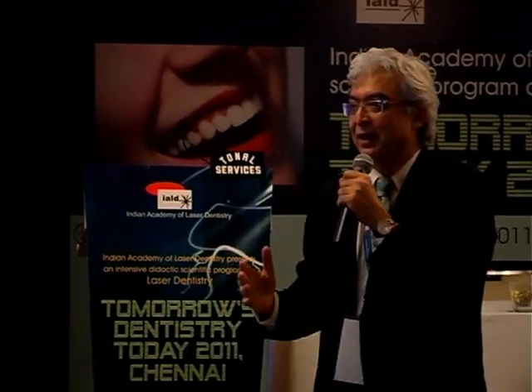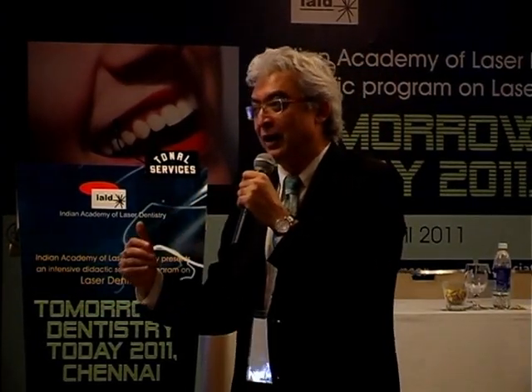One of the studies that I saw recently published said that it's more effective than your ultrasonic scaling in detecting calculus with this feedback mechanism. But we're still in early days. We need more research to actually come to a conclusion, but it seems like lasers can remove subgingival calculus very easily.